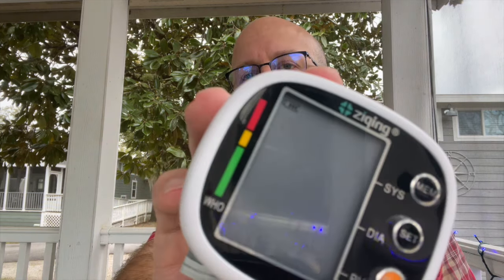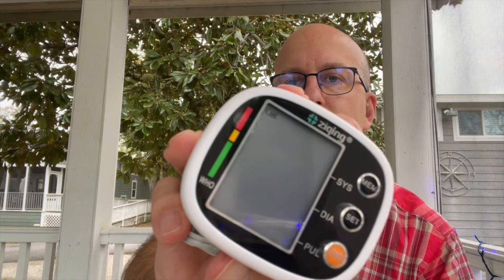The way to get to the user settings is to hold down the set button for three seconds and it should start flashing. You can see there — user number one. Then to change users, you just hit memory and you'll get to user number two. But what you really want to know about is how does it test, and it's actually pretty simple.